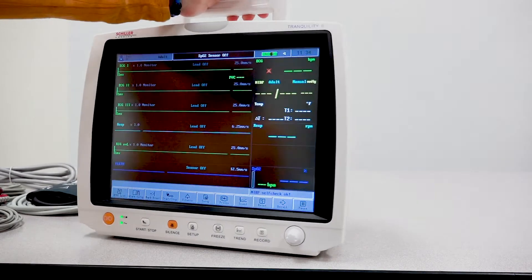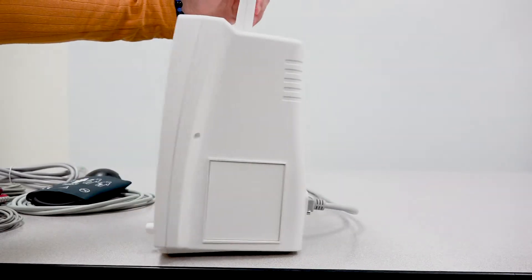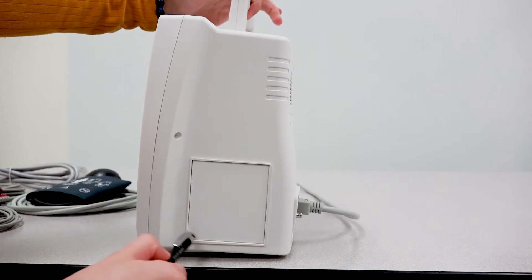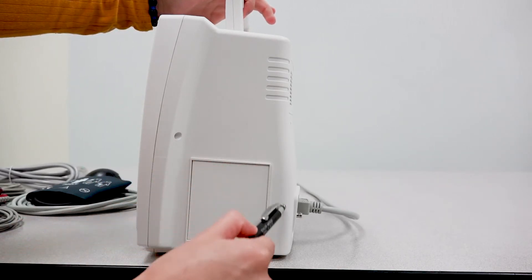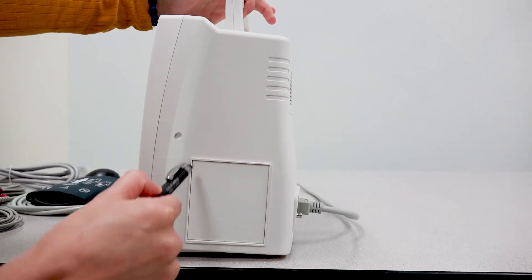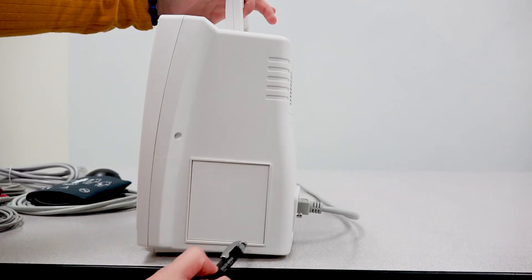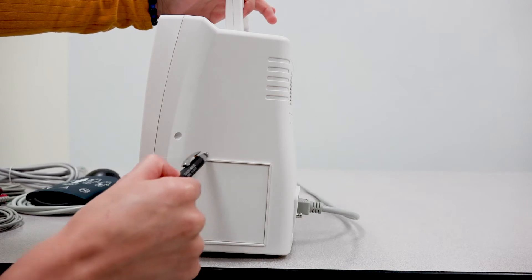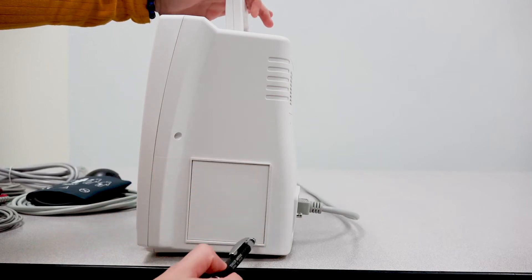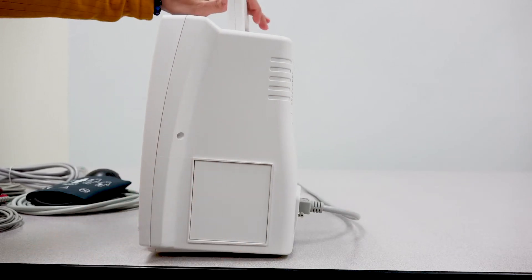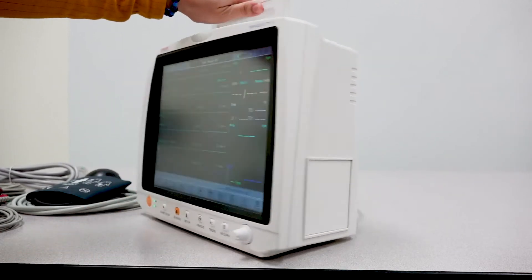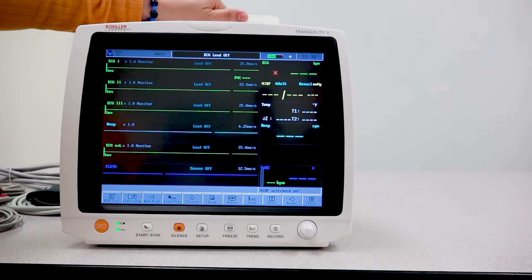On the right side, you have a section here that has a blank cover. But this is where you would have your thermal printer if in fact you purchased your Tranquility 2 with the printer.